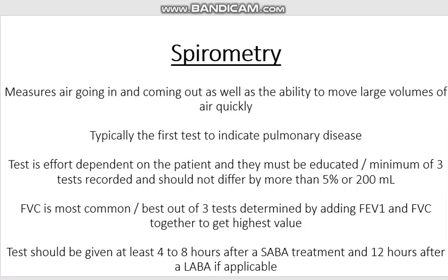Spirometry measures air going in and coming out as well as the ability to move large volumes of air quickly. It is typically the first test to indicate pulmonary disease. The test is effort dependent on the patient and they must be educated. Also, a minimum of 3 tests should be recorded and should not differ by more than 5% or 200 milliliters.